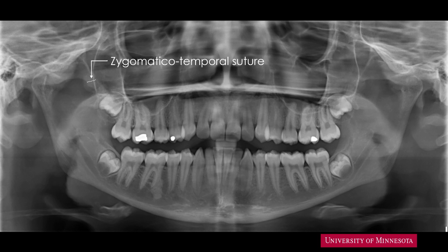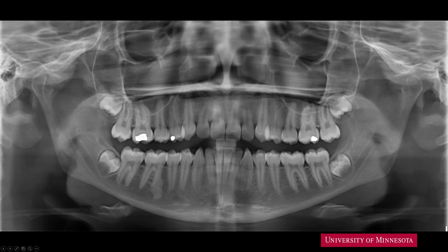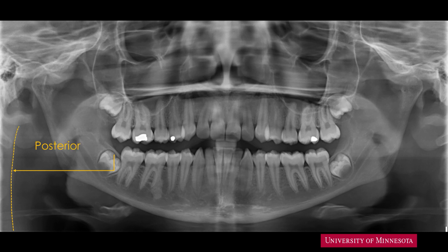At the midline between the central incisors of both arches is a rectangular radiopacity — this is the bite positioning block, used to position the anterior teeth in the focal trough. In some machines, a pencil-shaped bite block is used, so you may see a circular radiopacity representing the bite block. On the posterior aspect, we can see an outline of contrast representing the posterior pharyngeal wall. Please try to identify the posterior slope of the tongue and the epiglottis.